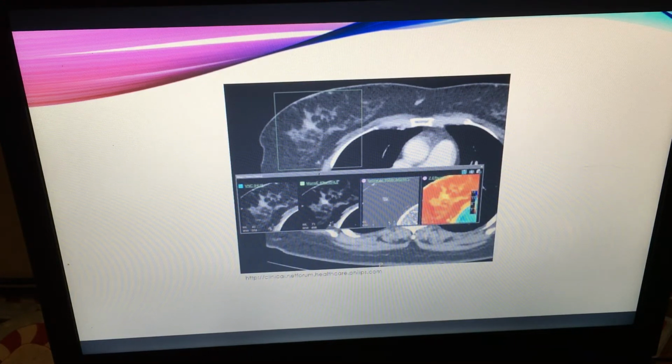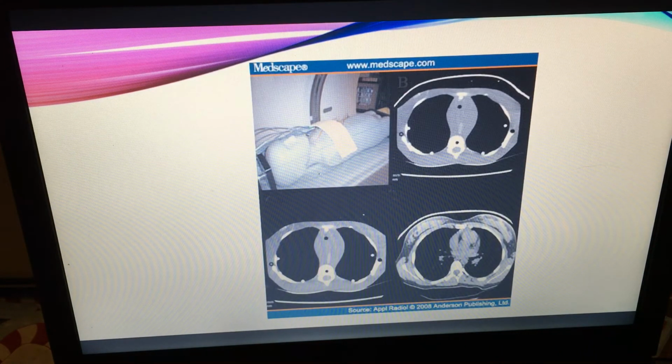The increase in these units can cause misdiagnosis by improper imaging, for example, a cystic breast lesion being diagnosed as a solid mass. Bismuth shielding also leads to poor image quality, which is one of the major cons in using them. They can cause streak artifacts and increase image noise.